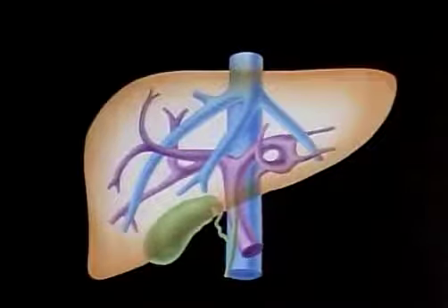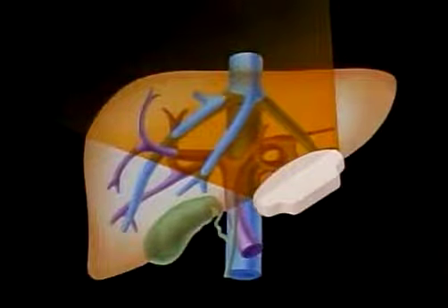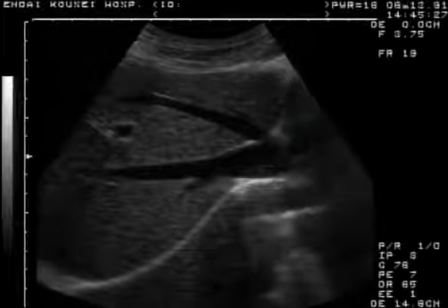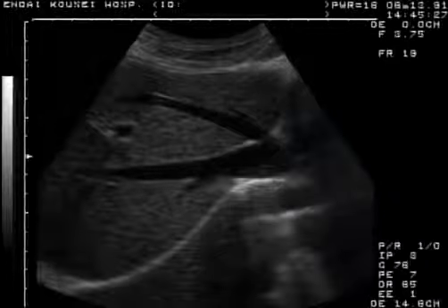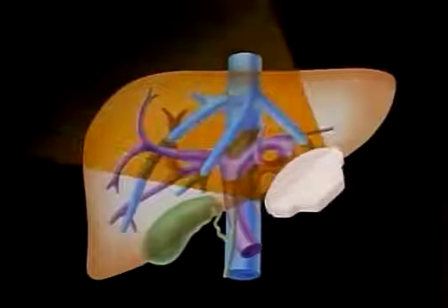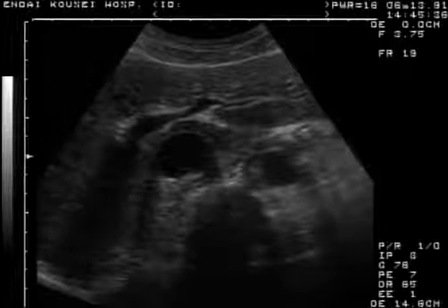On ultrasound images, the shape of vessels, bile ducts, and other lumen structures appears different depending on the plane scanned. For example, if the lumen is parallel to the scan plane, it appears as an elongated image. If it intersects a plane, it appears as a circular or elliptical cross-section.